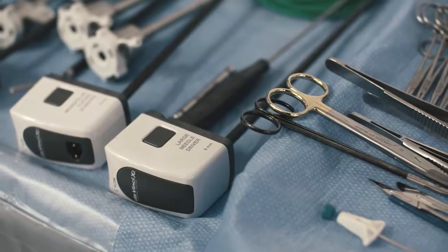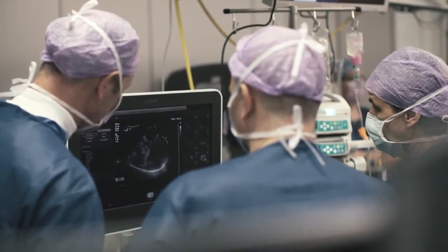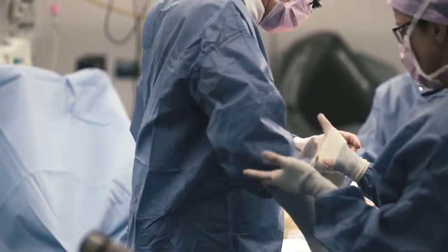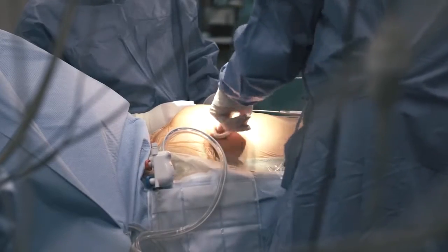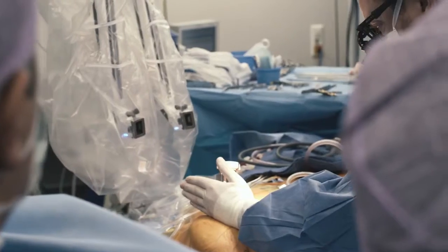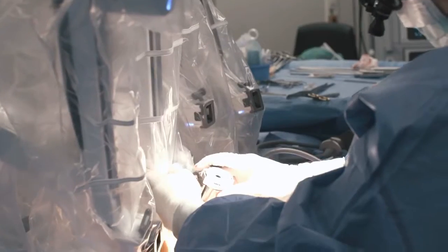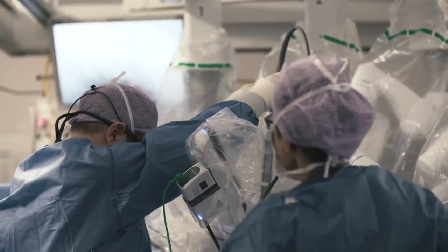Welcome to the Operating Theatre at the Clinic Hills London in Zurich. In this Operating Theatre, we perform all mitral valve procedures with the DaVinci. Cardiac ultrasound is the first step in assessing the problem and defining a precise operative strategy. The next step is to connect cardiopulmonary bypass through the groin and to gain access to the chest through a 4 cm incision in the right chest. Ports are inserted, and then begins the delicate maneuver of docking the robot to the patient. Once this is done, the three-dimensional optic can be inserted into the chest.